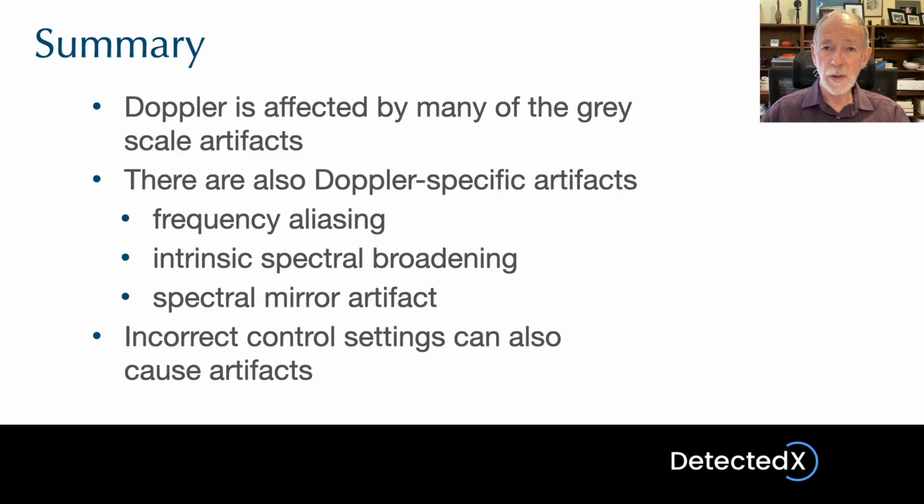Now, there are some other artifacts, and we'll cover those in the next lecture, and those are artifacts due to incorrect control settings. So we'll take a look at that in the next lecture.